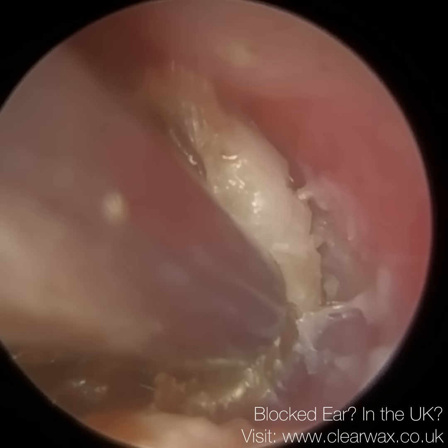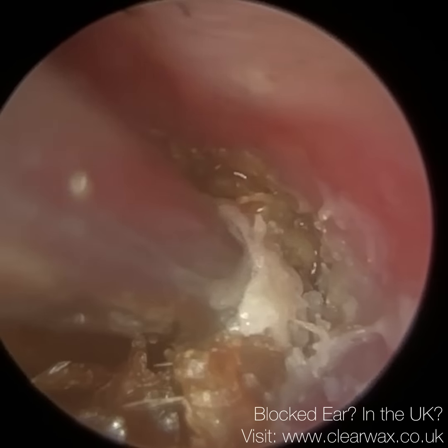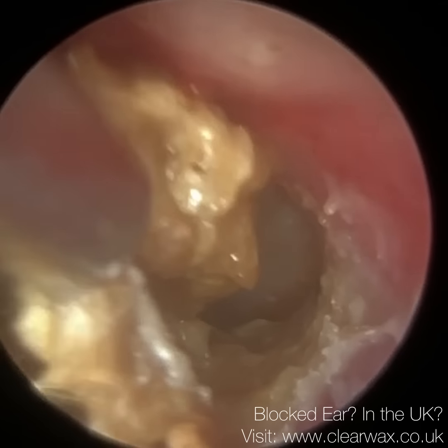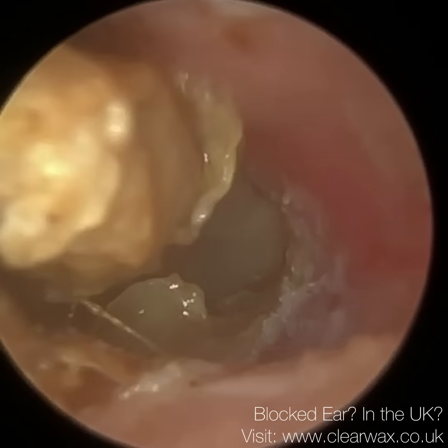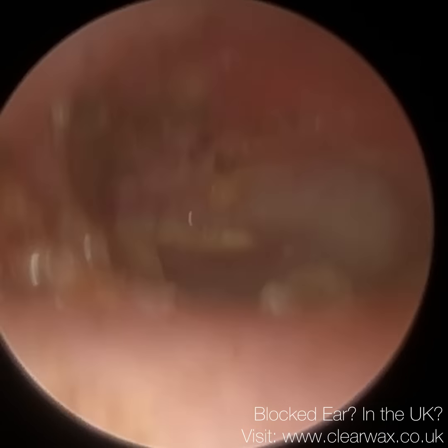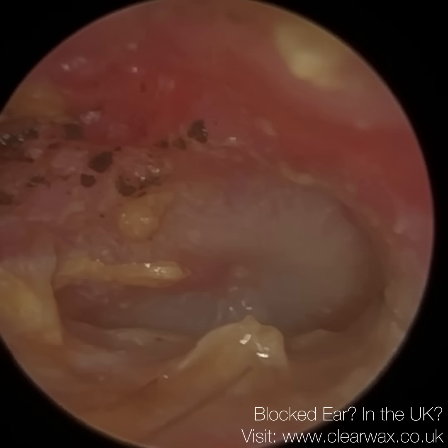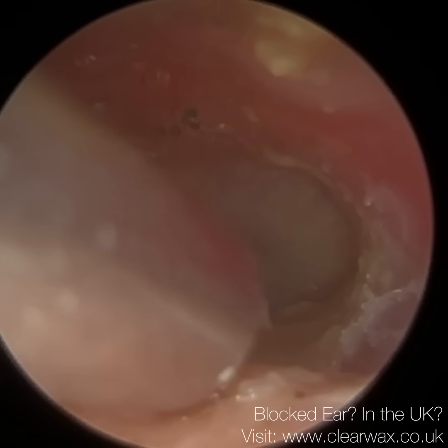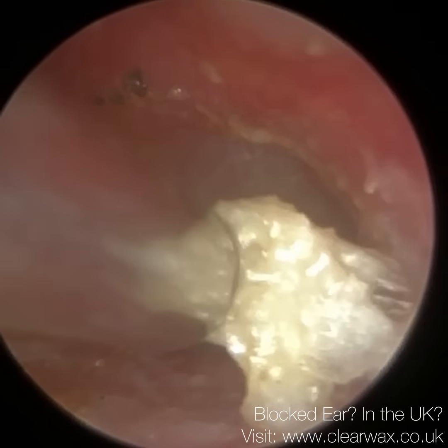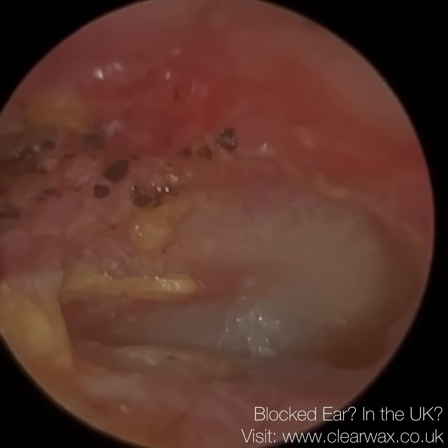So I'm just lifting this from the floor. It's really still strongly attached. So I'm just giving it this rocking motion. And the eardrum is now starting to reveal itself. You can see that in the distance. And I'm just going to mop up around the edge slightly. And the remodeling is just occurring beyond where the suction tip is. You can see where the ear canal is a bit more red. It's just a bit wider than the ear canal in front of it.